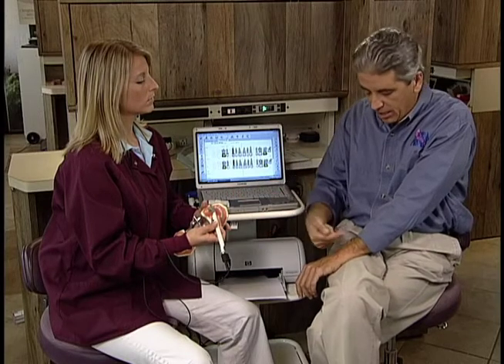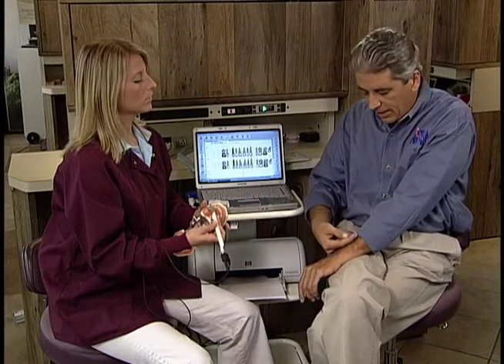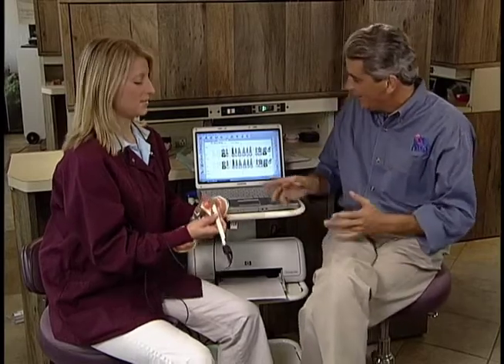If you probe and try to get that tactile sense back out of this probe, it comes from pushing on the free gingival margin with the sleeve of the handpiece. If I'm blanching or pushing on the margin, then I'm in effect making the pocket shallower. So it is visual acuity. You need to make sure that you can see it. You wear loops. Yes. That's a really good practice, not only for this, but for your own ergonomics, because I'm sure you've learned already. Okay?